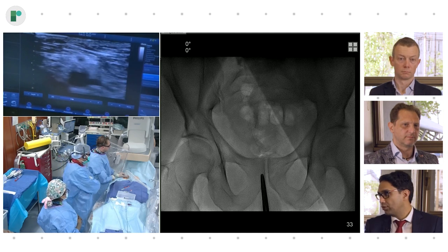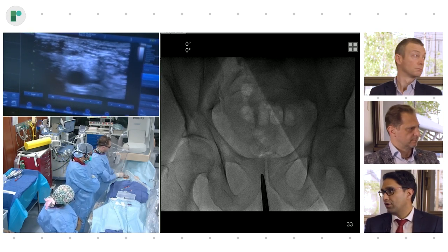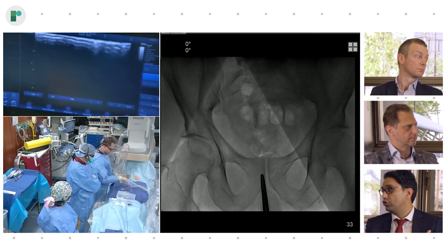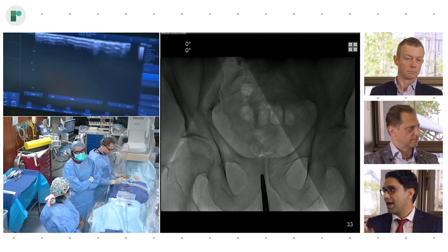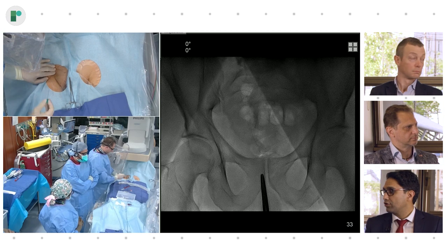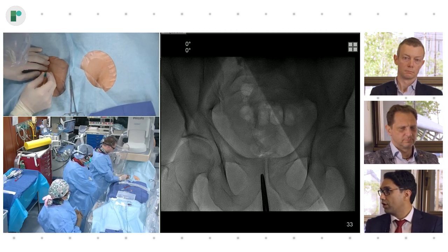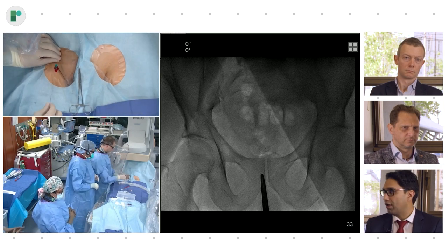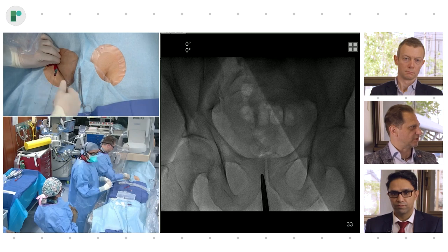So there's a couple of reasons why we do that for femoral access. The reason is the two French dilator, obviously, if you do end up puncturing in the wrong place, the amount of time you need to hold pressure is dramatically reduced because the radius is so small. But the two French dilator does allow you to connect the syringe to it and take an injection through it, so you can know where you are with a very, very low profile. And a minimal amount of contrast also, because obviously it's so small, you don't need much to fill it.